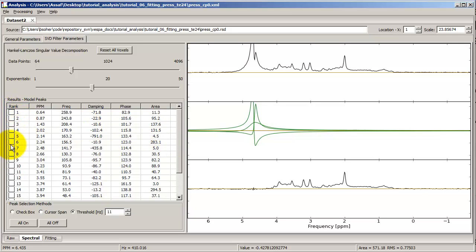So here on the first column, the rank, we can select which peaks we want to include in the middle spectrum. And each peak, as you can see, is characterized by a bunch of parameters, being the ppm, the central frequency of the peak, here it's in hertz, the damping coefficient, basically like an effective T2, but not in units of T2, the phase of the peak, and the total area of the peak.